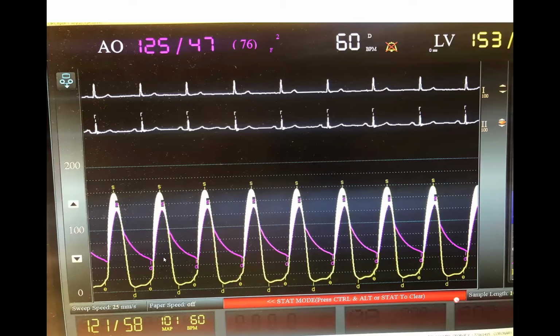However, you are correct that swapping the transducer will not correct the issue of the actual catheter itself. It will correct a lot of other issues that we encounter frequently: tubing length, air bubbles, different stiffness of tubing, etc. You want to keep your tubing as short as possible when you're doing those measurements, and limit the number of stopcocks. The more you add things, the more you damp, the more you introduce errors.